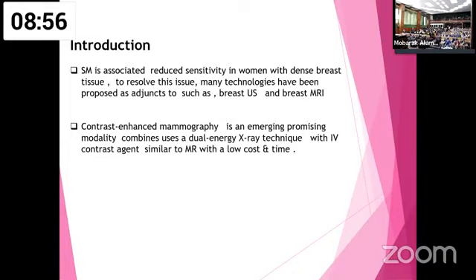Contrast-enhanced mammography is an emerging modality that was commercially introduced in the year 2011. It uses the combination of dual energy imaging and intravenous administration of iodinated contrast material to visualize the breast neovascularity in a fashion similar to MRI.